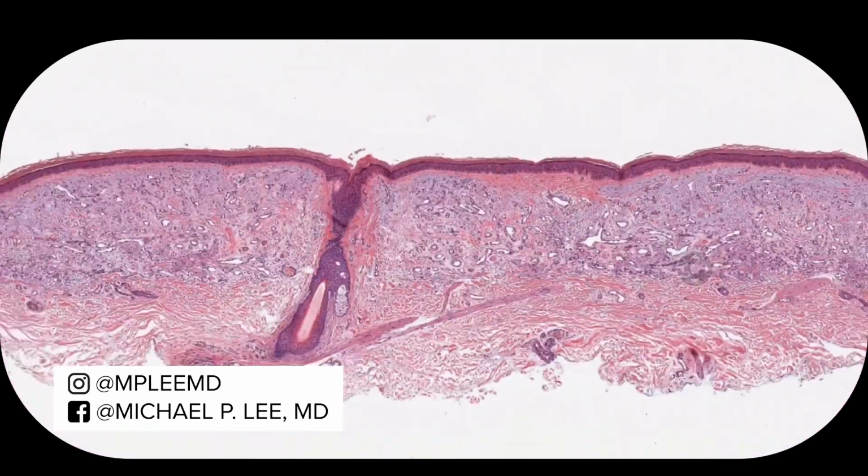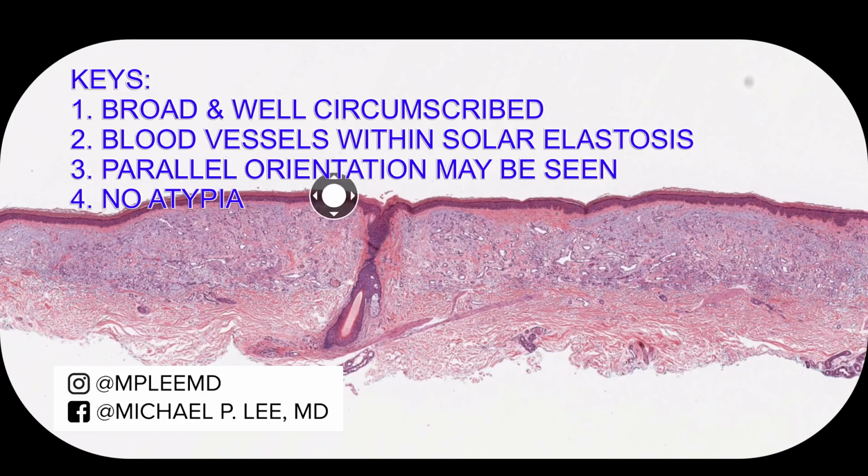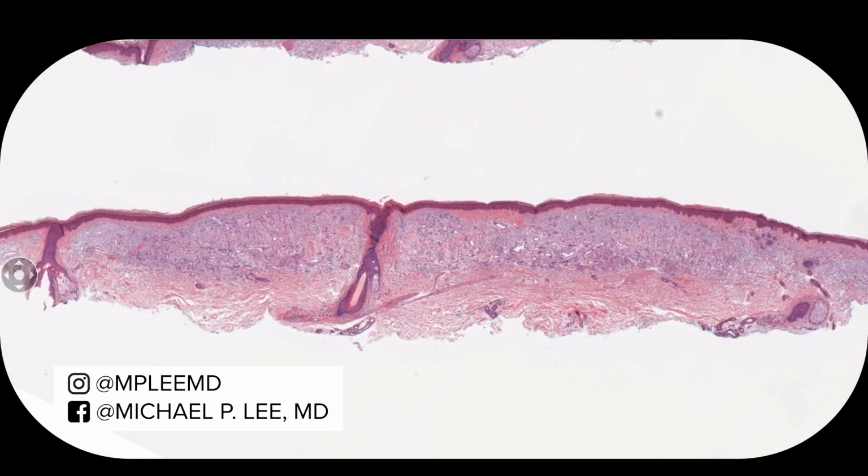The main keys to the diagnosis are a well-circumscribed proliferation of blood vessels. Some of the blood vessels are oriented parallel to the epidermis, all contained within the solar elastosis. And you can see it abruptly stops right there along the base. It's a quick and easy one.